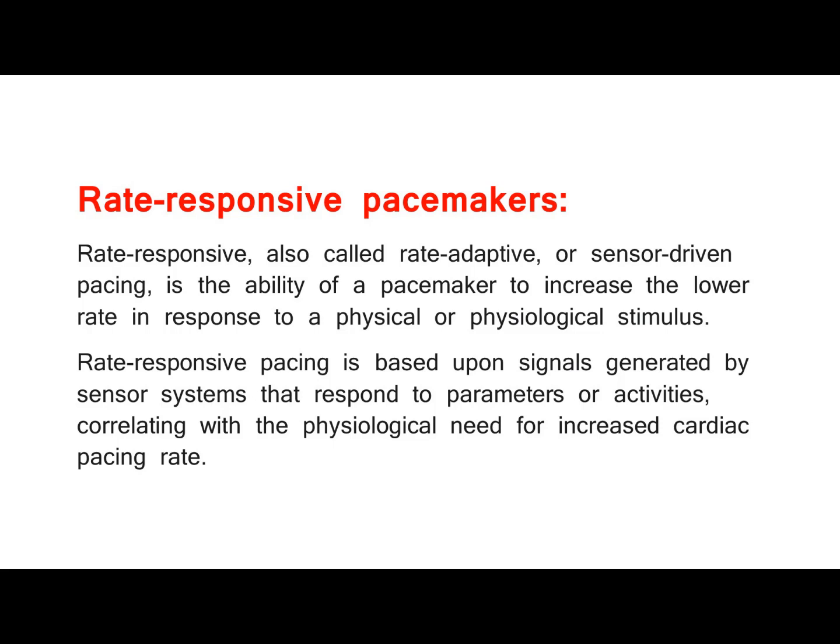Rate-responsive pacemakers. Rate-responsive, also called rate-adaptive, or sensor-driven pacing, is the ability of a pacemaker to increase the lower rate in response to a physical or physiological stimulus. Rate-responsive pacing is based upon signals generated by sensor systems that respond to parameters or activities, correlating with the physiological need for increased cardiac pacing rate.